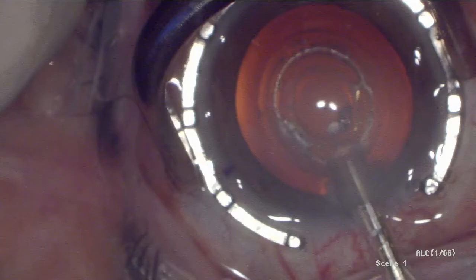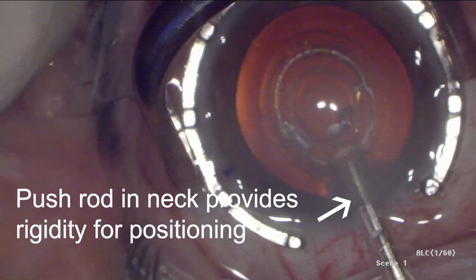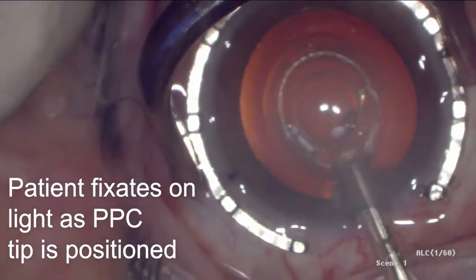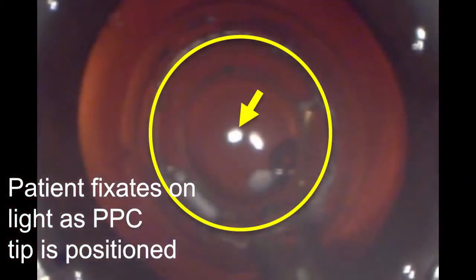It was very important during this step to only pull the push rod back until its tip was just outside of the nitinol capsulotomy ring. By leaving the rod at this position, the rigidity of the device neck was maintained, facilitating PPC tip positioning. It was also useful to use the capsulotomy ring, here outlined by the yellow circle, for P1 centration.